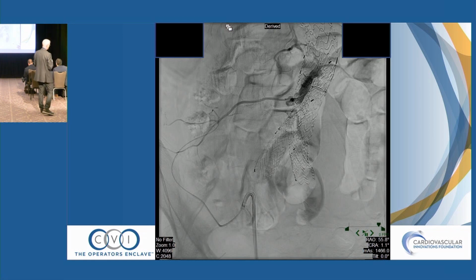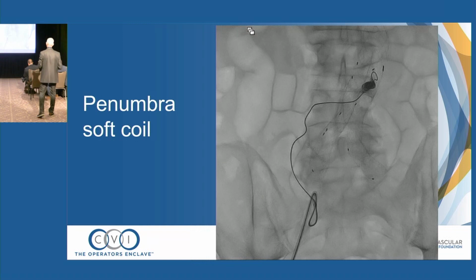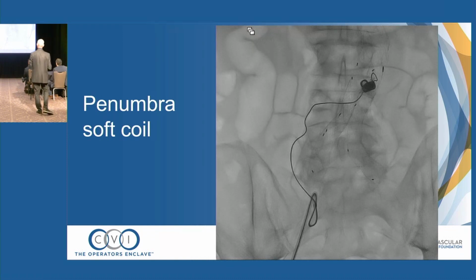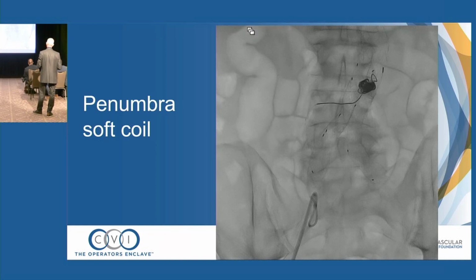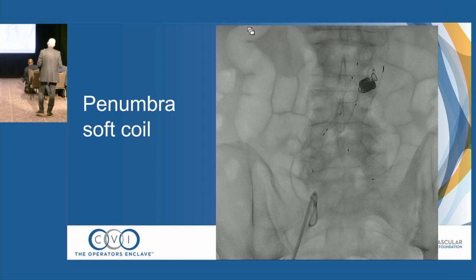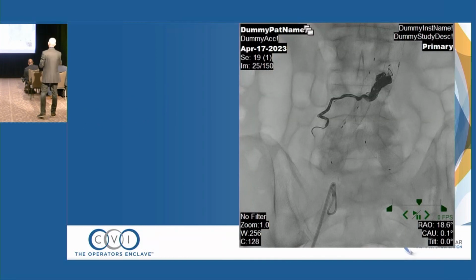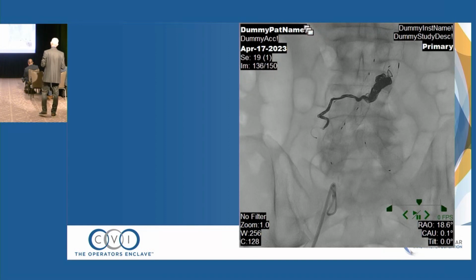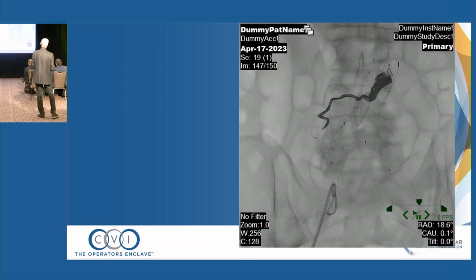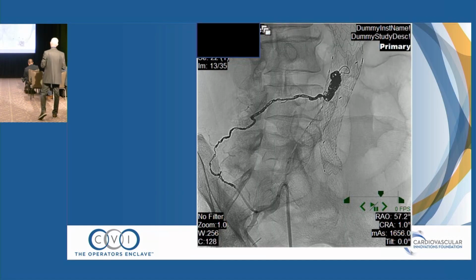And so my goal typically is to try to anchor the coils in the aneurysm and then work back into the peripheral artery. So here you can see this happens to be a Penumbra. Any of the variety of companies, you can see how this slides in. You really can't hurt anything. You're inside an aneurysm. I'll just show you some quick pieces of this. I'm not sure you can embolize too much. I've never had anybody get paraspinal claudication or some kind of muscle pain from these coils, but it does make you wonder sometimes after you throw a lot of this metal in.